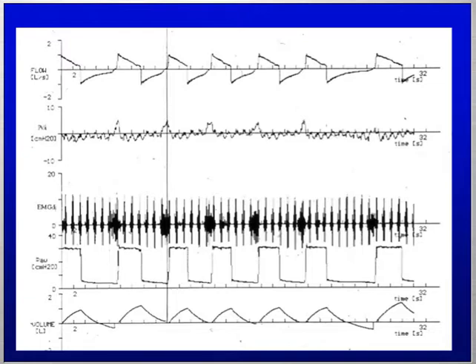And compared to the breath, it's only to trigger the ventilator. All the insufflation time is in fact passive insufflation. The patient is doing nothing, just triggering. So there is a total loss of synchrony between what the patient is doing and the insufflation of the ventilator. What can be the problem? Well, two kinds of problems very well described.